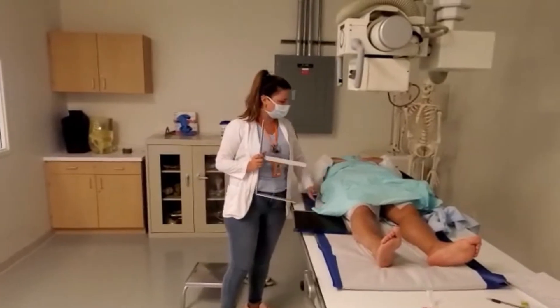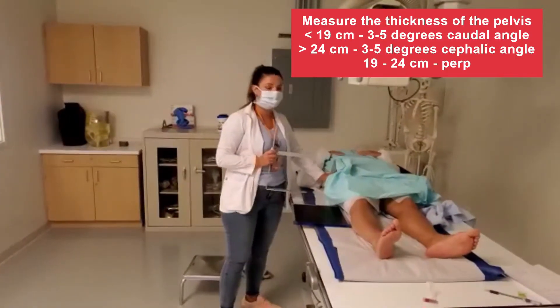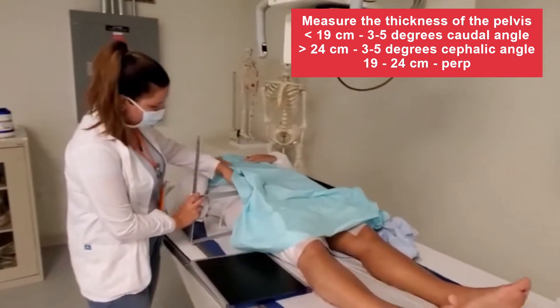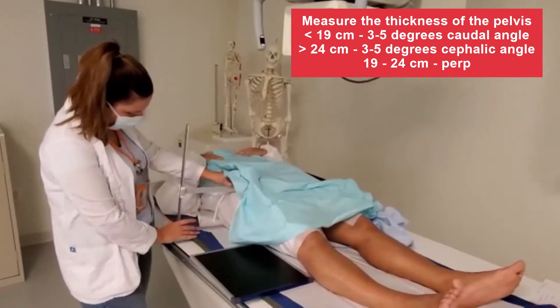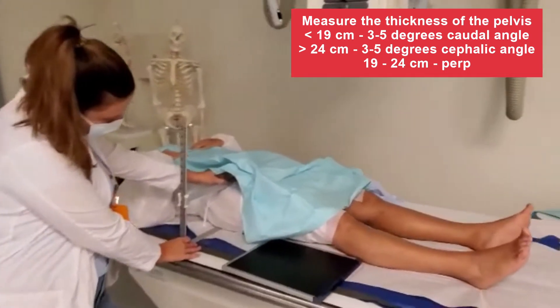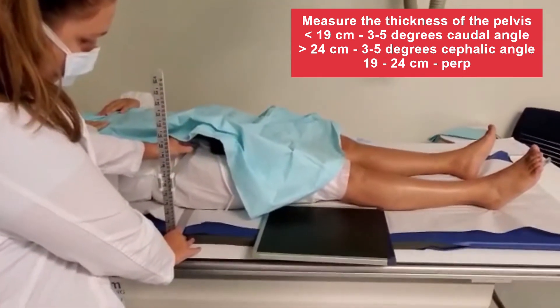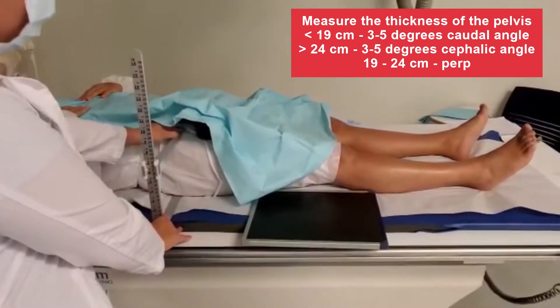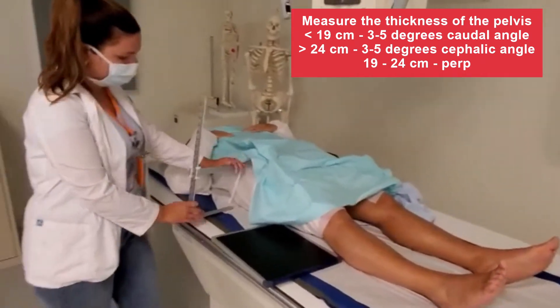How we usually do that? We palpate the ASIS, and the distance will be measured from the ASIS to the table. In our case, the distance is less than 19 cm, which means that we do not have to angle the tube up, or we do not have to keep it perpendicularly.